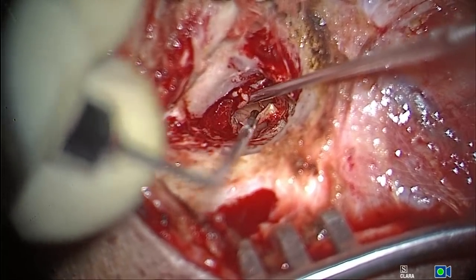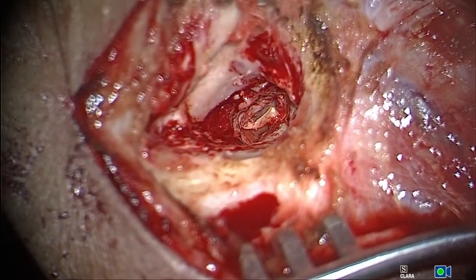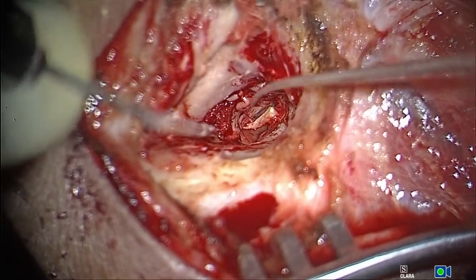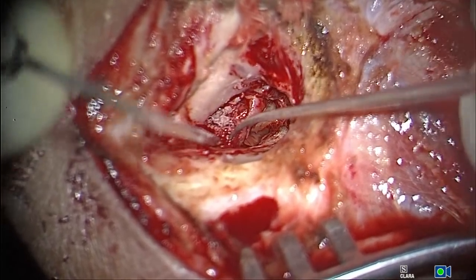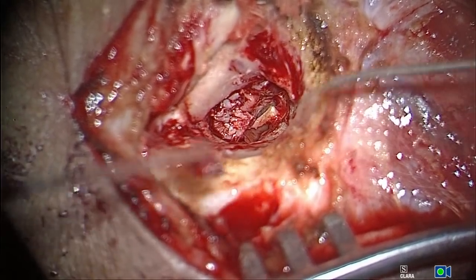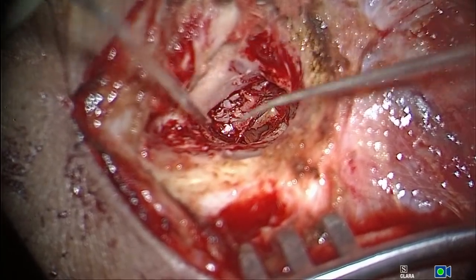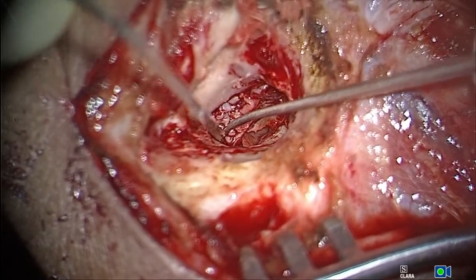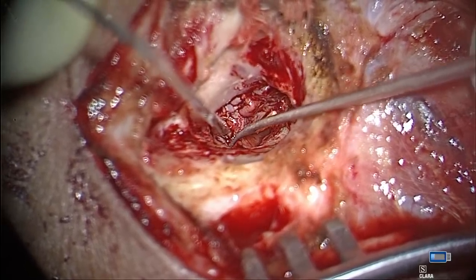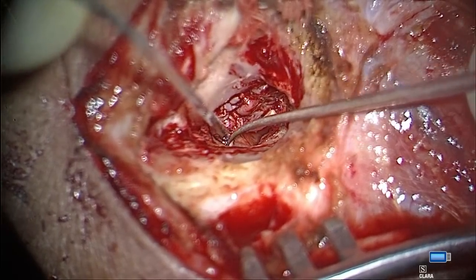So anything done with the scissors looks beautiful. Believe me, the scissors is to me one of the best tools in surgery. And the same thing I do in skull base as well, the use of scissors a lot. If you use the scissors or the knife, there is no force. Most of the surgery looks bad when you pull.